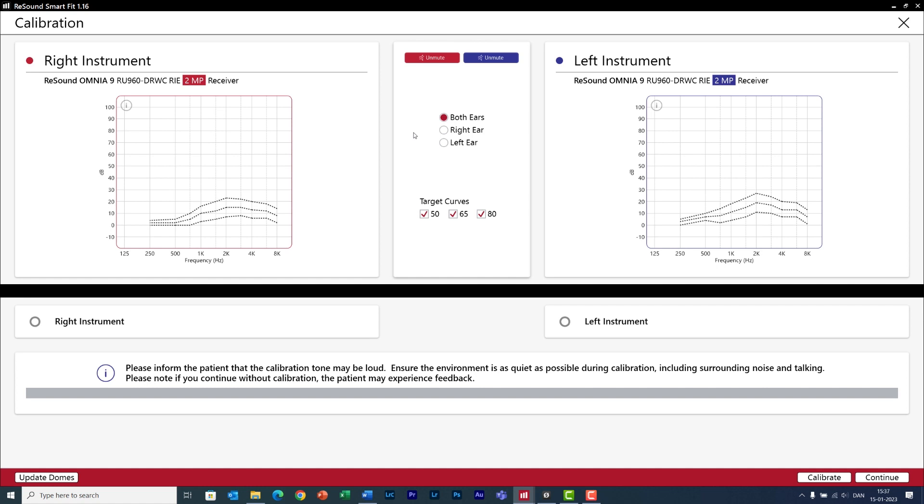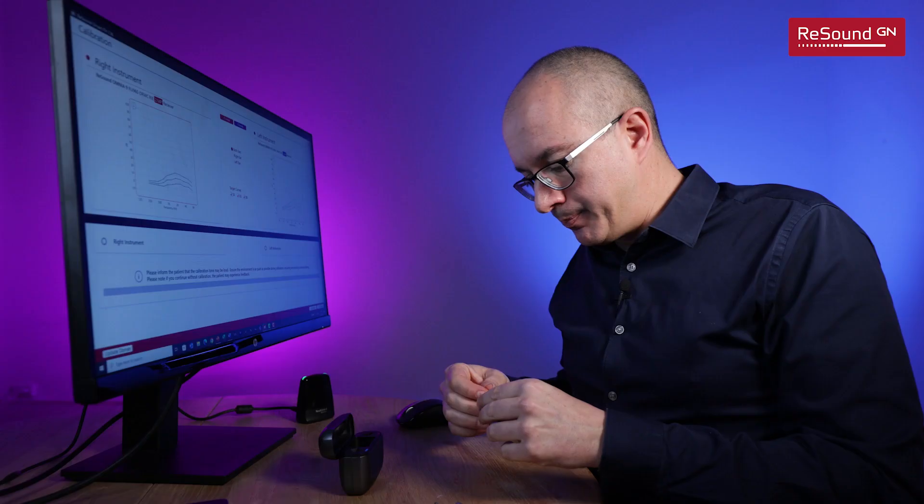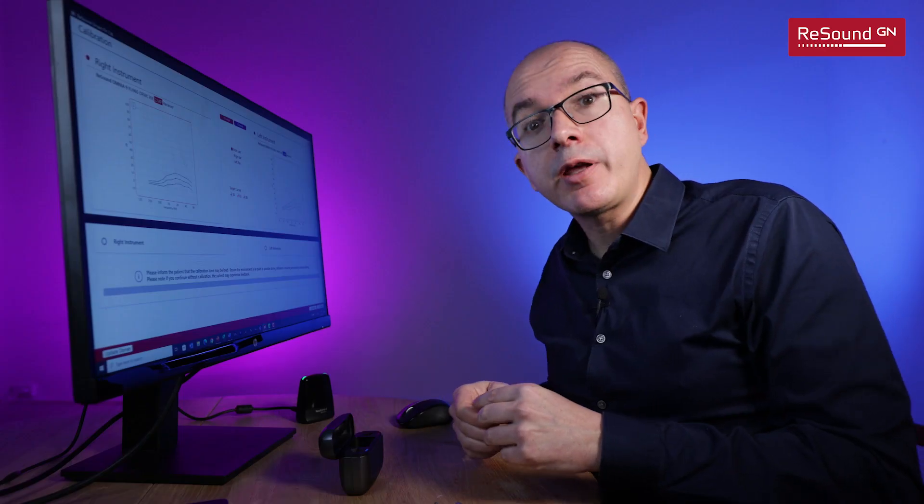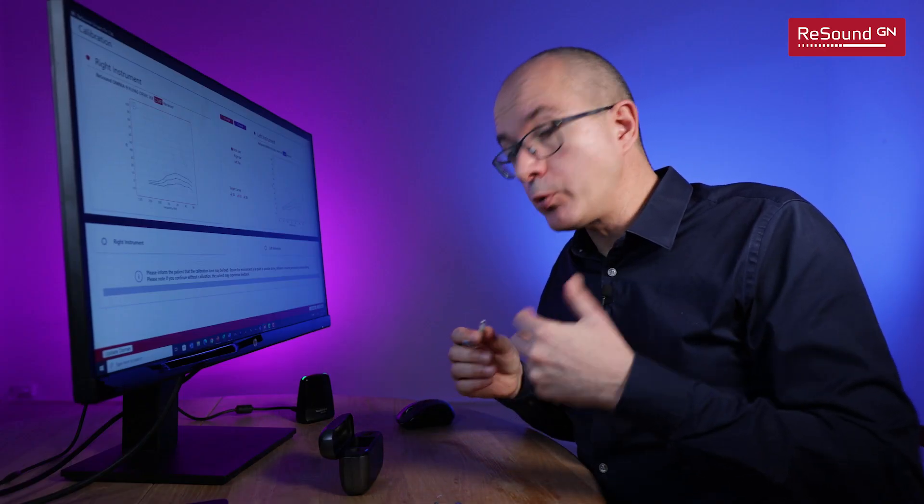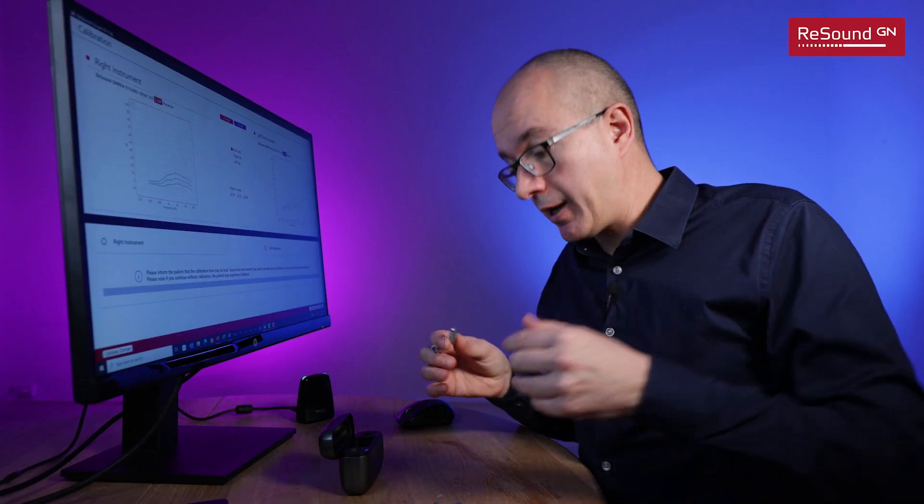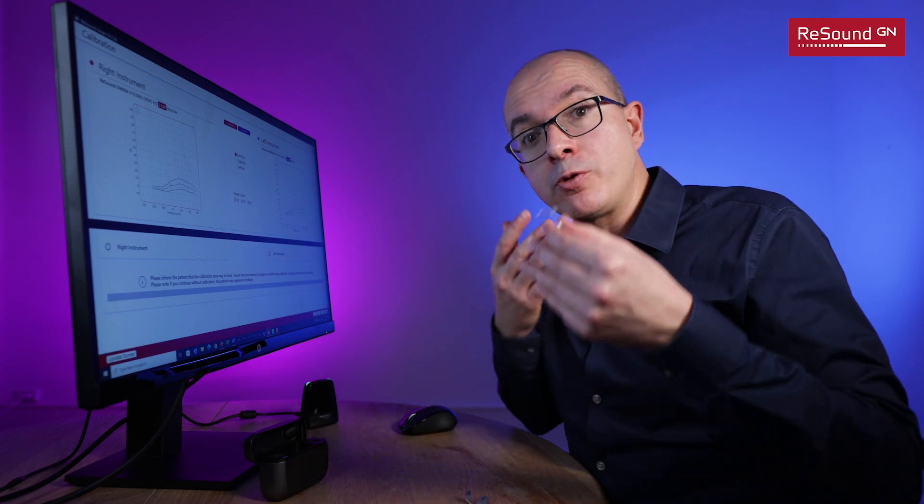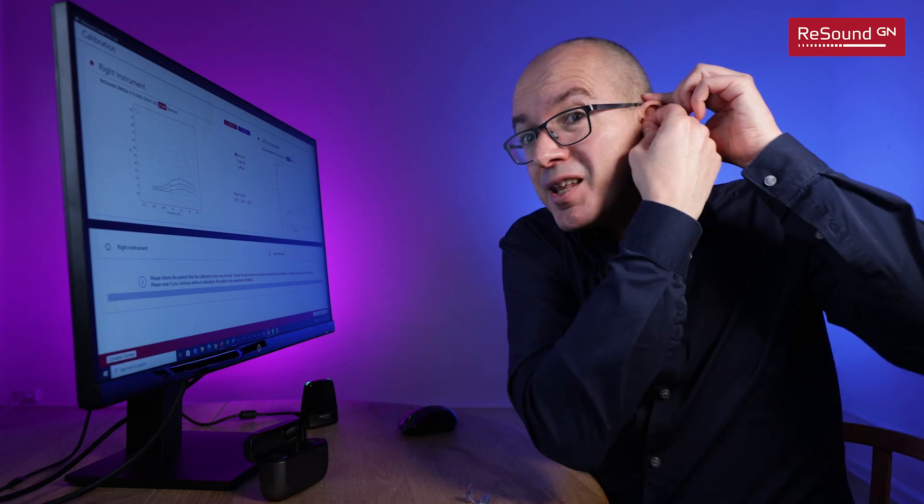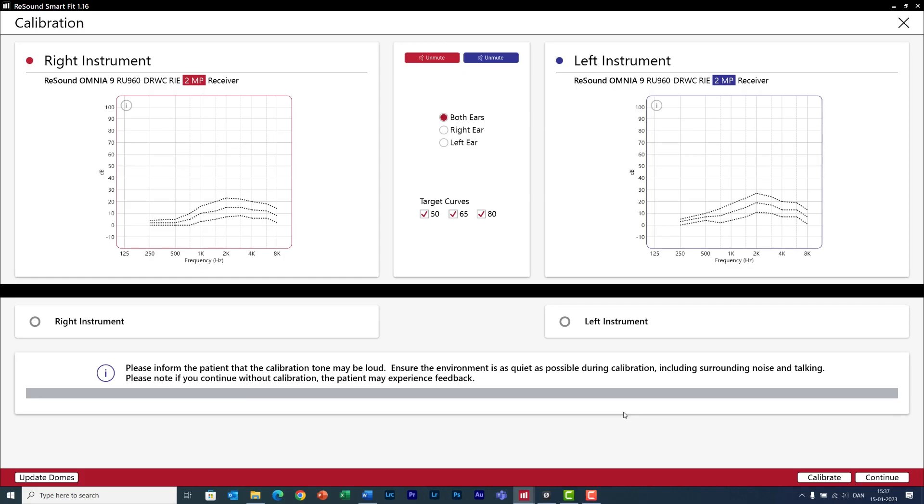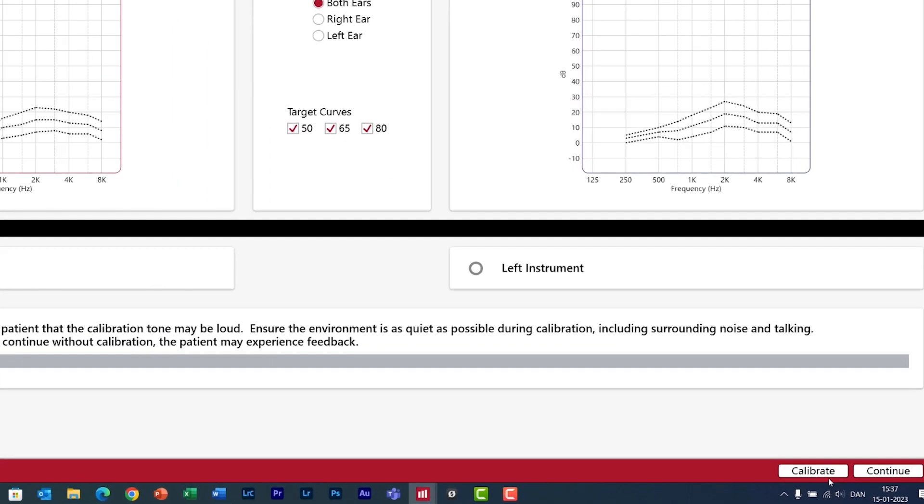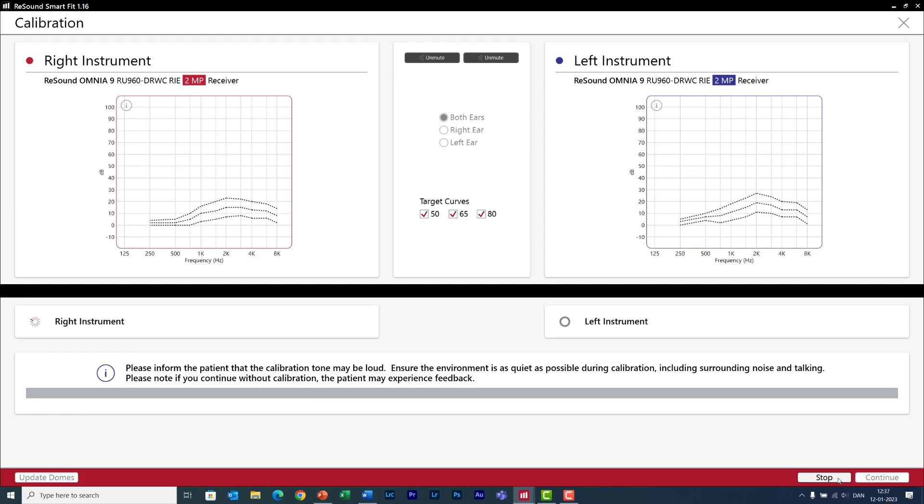This is the first time I will put on the hearing aids on the ears of my client and note how both hearing aids are on mute. Jack is not here so I'm going to pretend to be Jack and do the feedback calibration on myself. Let me put the hearing aids first. Click on calibrate.